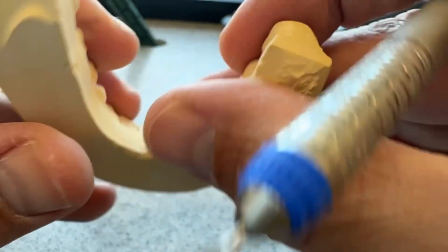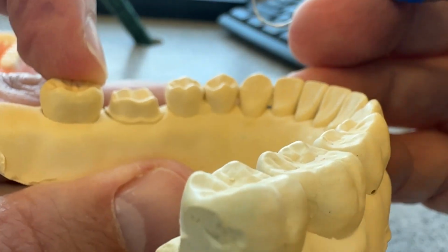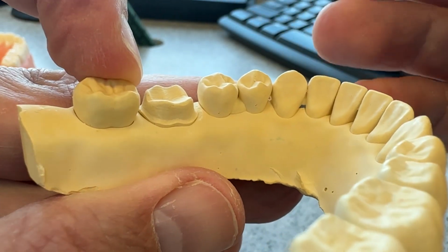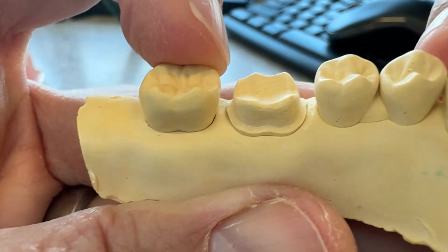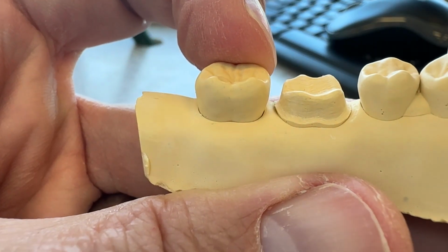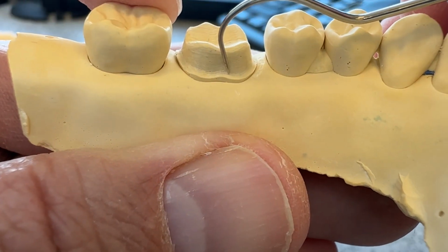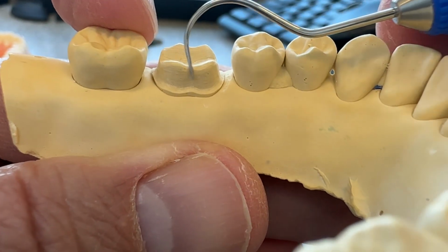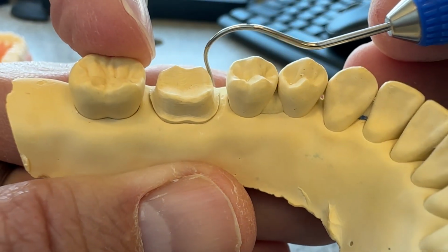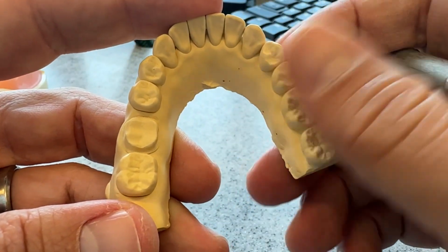Try to avoid that. If you start at about 1 millimeter supragingival, that gives you room to define it and come farther down. But again, no ski jumps as we come through interproximally on those margins. And then the margins are well defined and smooth. You can see that the axial is nice and smooth. Line angles are smoothed off. Everything is smoothed out well.